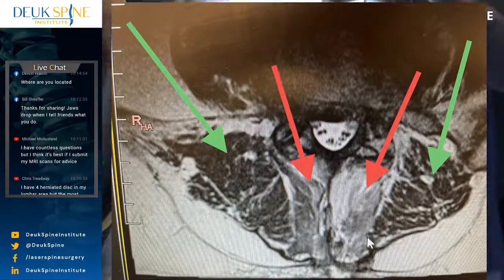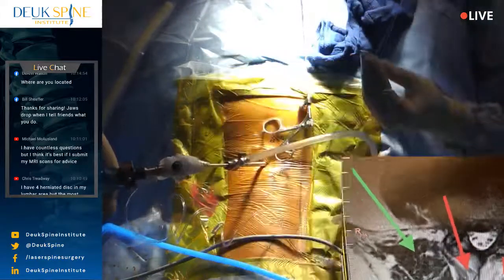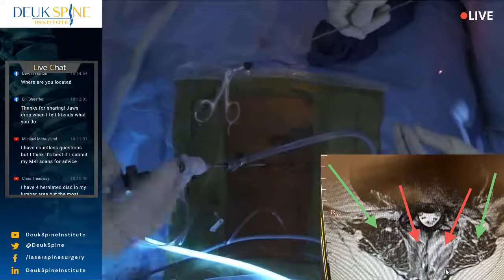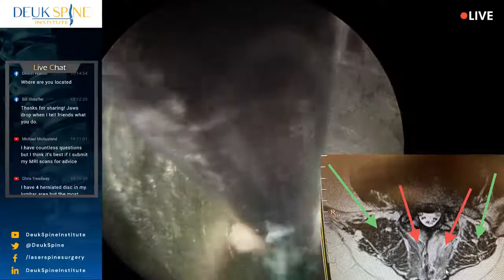I didn't do the laminectomy. I don't do laminectomies, okay? I don't do microdiscectomies because they kill the muscles. And people need your muscles. That's where pain comes from after surgery, is the muscles. So if the muscles are damaged severely, the pain is gonna come from the muscles. And that's why so many people have pain after surgery, because the surgeons just kill the muscles. Why do they do it? They don't do it on purpose, folks. This is how they're taught to do it. And they don't know any other way, but the surgery you're watching now is the other way. They just have never been trained to do it.